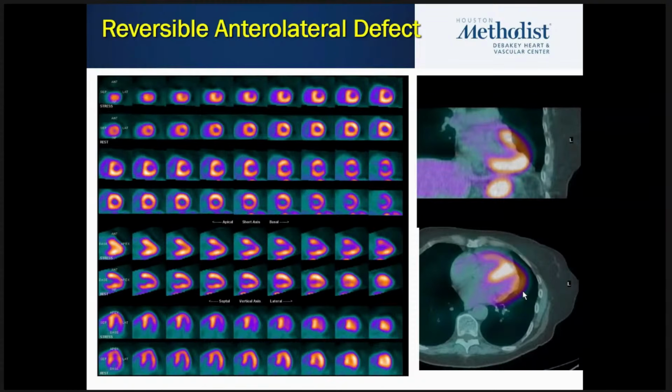So how do we fix that? All vendors give you the ability to move these images around and reprocess them. And this is what we did here. We moved the heart to where it should be, not overlaying the lung, and now we see a nice normal image.